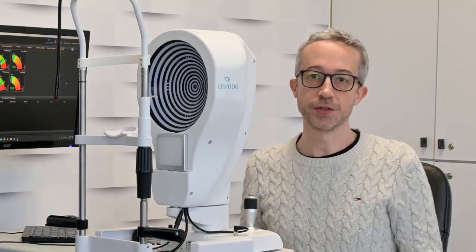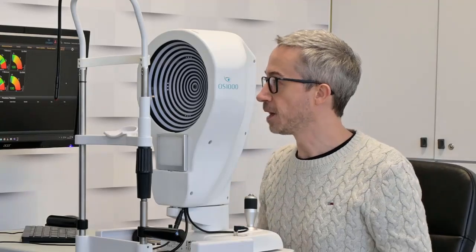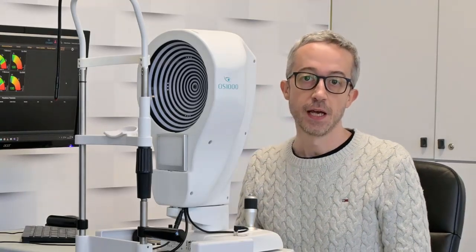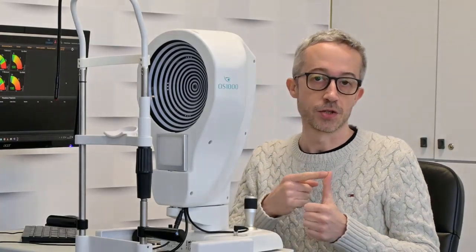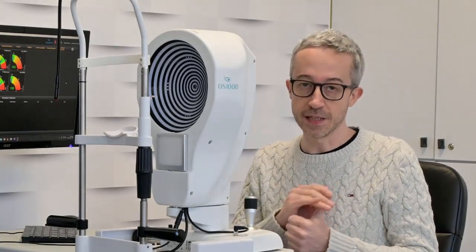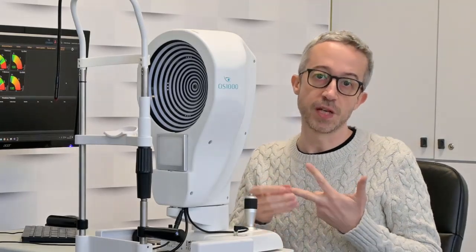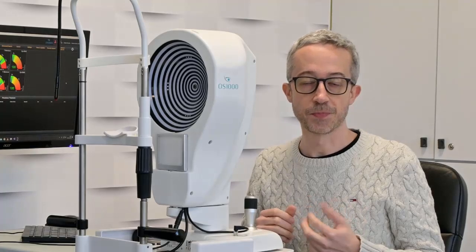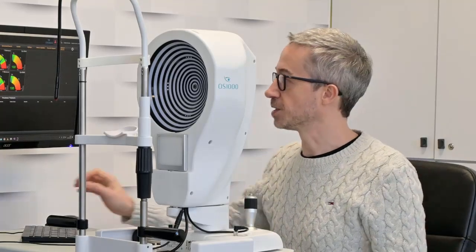After you completed all the acquisition, you have a panel with all the results. Now you can either show the single exams, pictures and video, and comment them with your patient. You can assign a therapy. You can print the results. So let's start with watching together the exams with the patient.